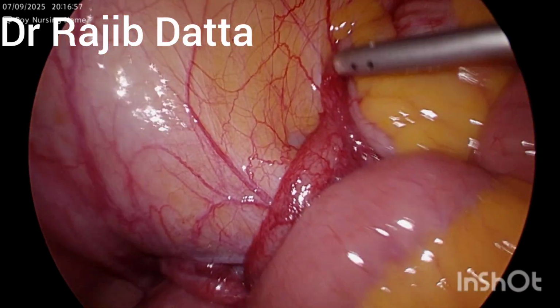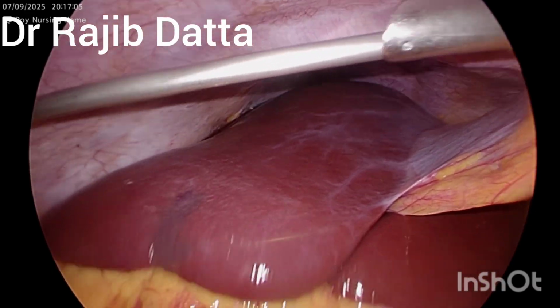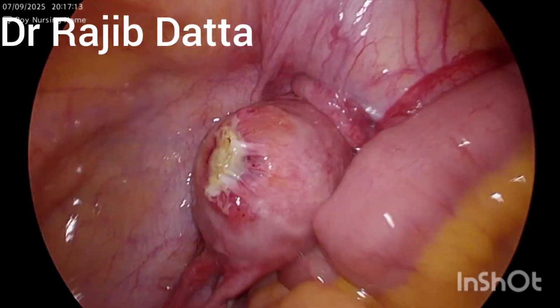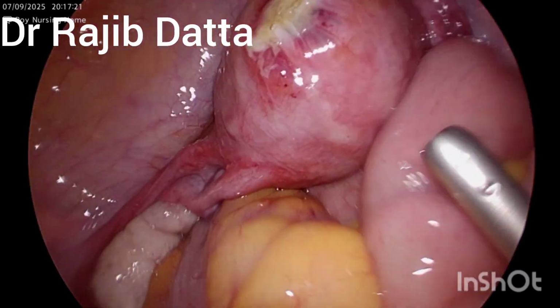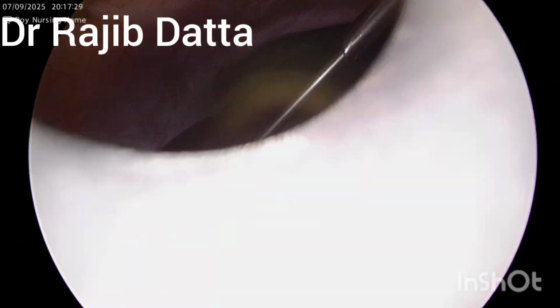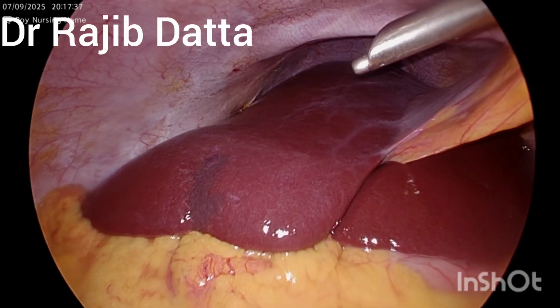That is quite good. The appendix is also normal, and proper delineation is done, and the uterine fibroid could be there, and that has been taken care of. So our job is done. Thanks.